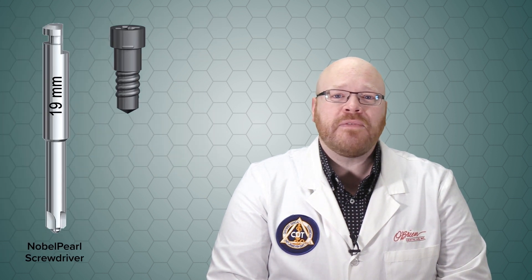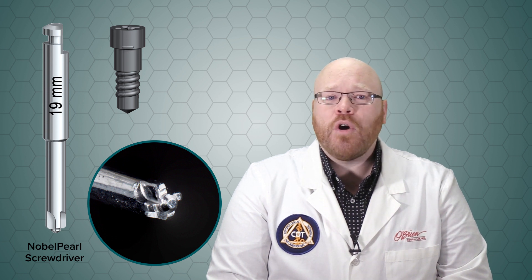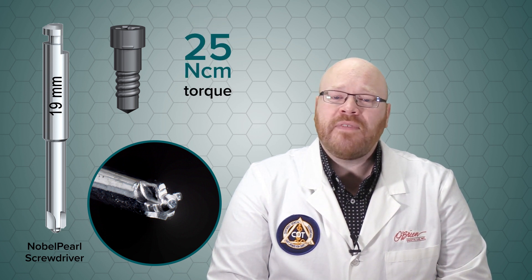The screws do require the new Nobel Pearl screwdriver, which is very similar to a small Phillips head screwdriver, and unlike other Nobel screws, they're torqued to only 25 newton centimeters.